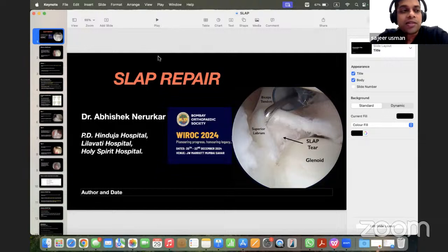The insertion process is so minimally invasive that I think these anchors are the way to go, at least currently. PEEK anchors would be my second option, if this does come out or we are looking at very soft bone. Additionally, I also keep some metal anchors for the remplissage, because most often this cancellous bone tricks me and the anchor just comes out after application. So a metal anchor, a PEEK anchor, and an all suture anchor, everything will be there on standby.